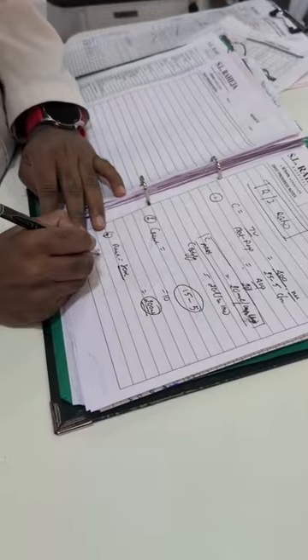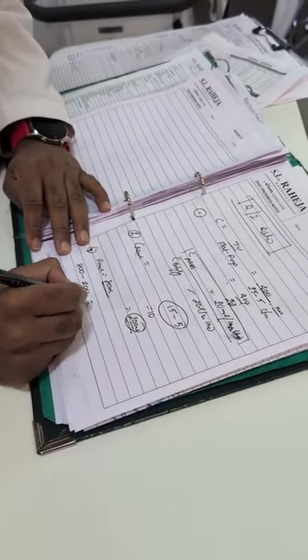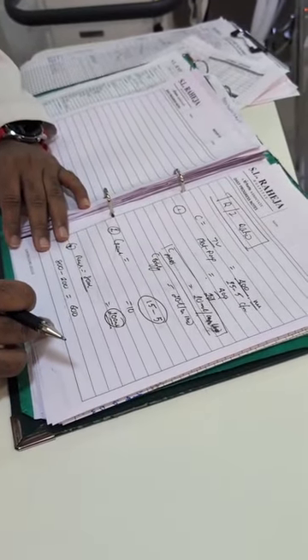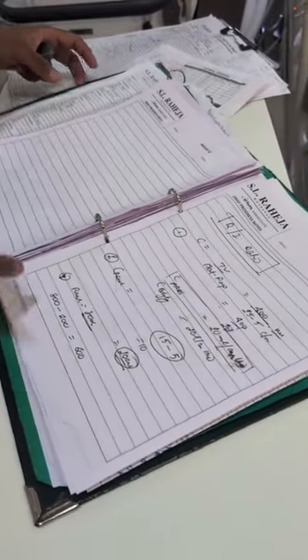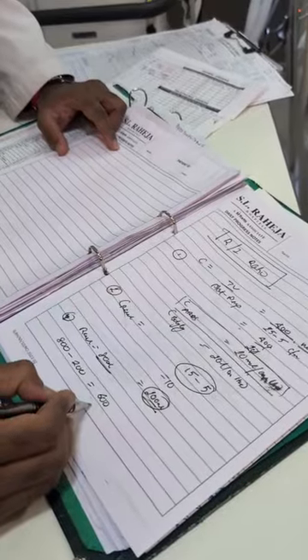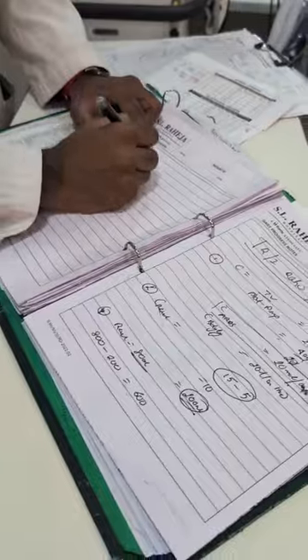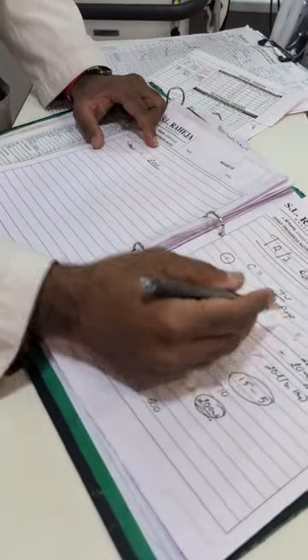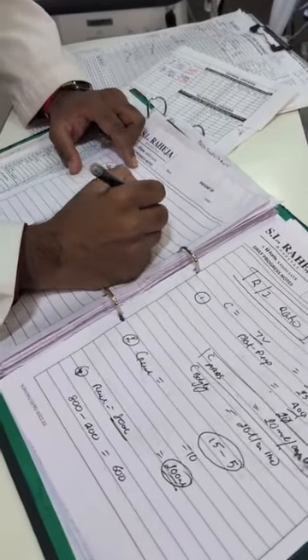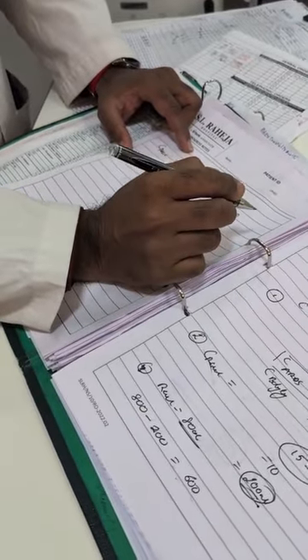So 800 minus 200, that is I'm removing this out, is equal to 600. That means I was expecting 200 but 600 came. I was expecting it to be 400 minus 200 is 200, but 600 has come here. Now I do the compliance of the recruitable lung. That means 600 divided by plateau pressure minus PEEP, 15 minus 5, which is 10, which makes it 60 ml per centimeter of water. Understood this?